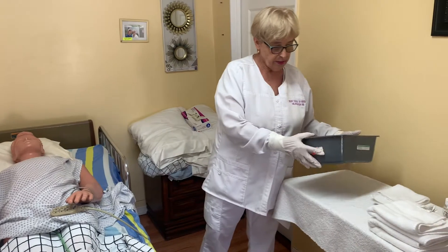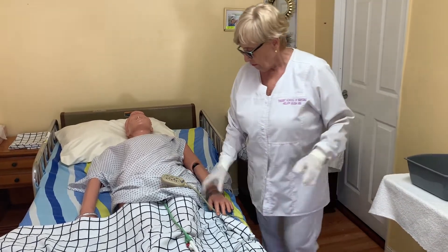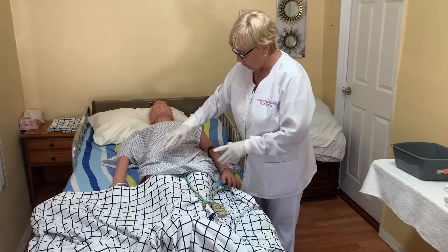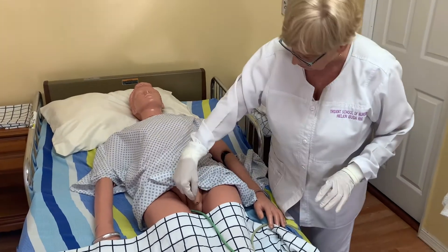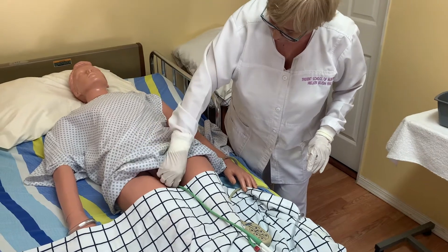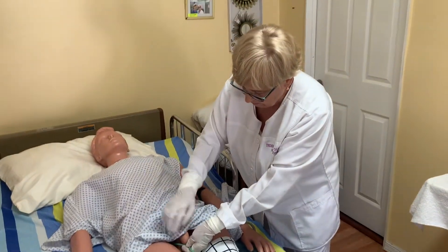I brought the water. Is this water good for you? She said okay. I'm going to expose only the part I need to take care of. This is a male, and we have a Foley catheter inside the urethra — which is not actually inside here, but we will pretend it is.